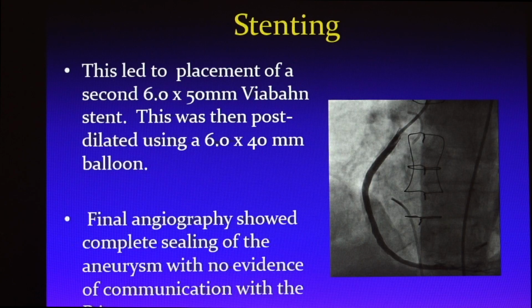Actually, what's interesting, the SATs went down from 85 to 65 within 10 minutes. And the systolic pulmonary artery pressure went 10 millimeters down from before the intervention, which was very significant as well. So you can see here, we got very good results at the end.